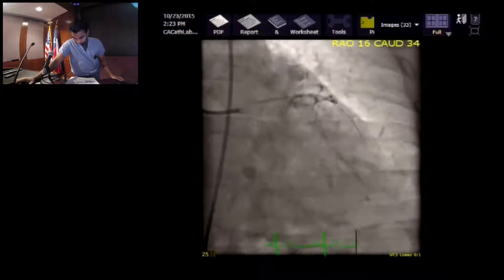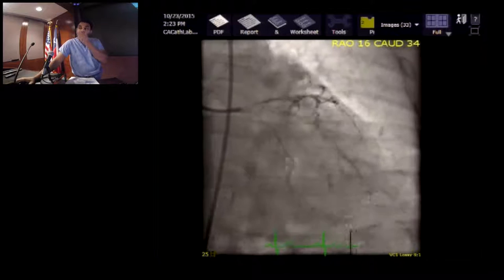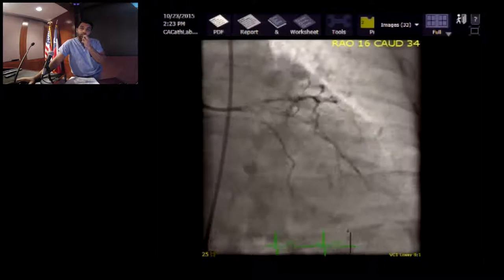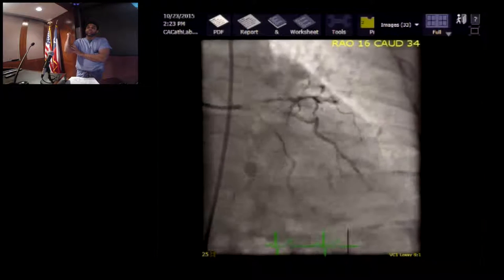So an IVUS was done. If the FFR is positive, what would the IVUS make a difference in terms of? I think IVUS would guide us a little bit better as to what the significance of the ostial lesion is. You've got a tight diagonal lesion, a tight LAD lesion, and then you also have this borderline-looking LAD ostial disease. Well, maybe the FFR is low because the LAD ostium is major, and the whole thing downstream is going to be abnormal.